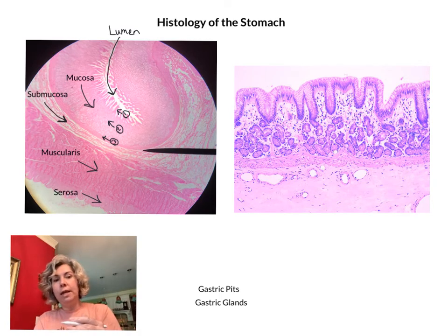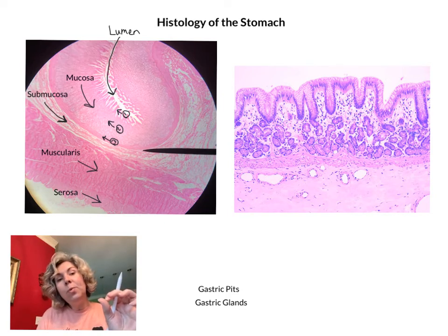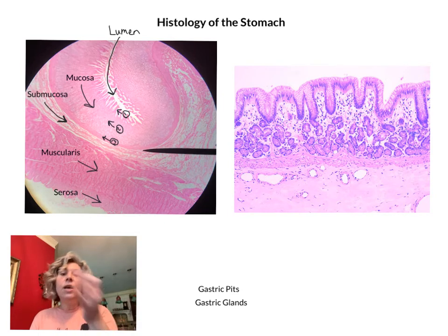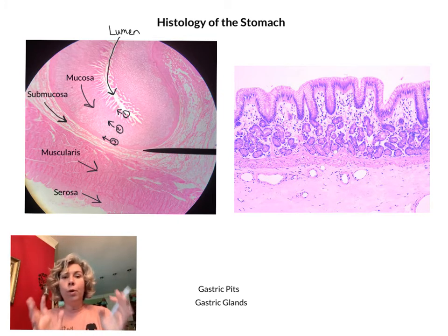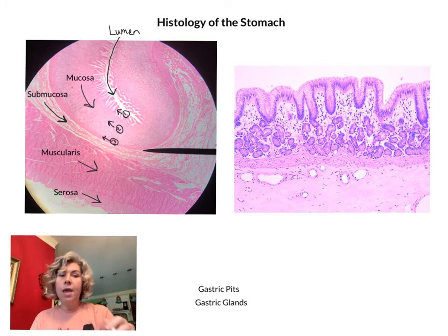The outermost area that comes in contact with the body cavity, the very bottom of that serosal layer, is epithelial tissue. It's actually simple squamous epithelial tissue. This is what we would call the mesothelium. And then a little bit deeper within, in contact with the muscularis, there are layers of connective tissue that help to support and attach your serosa with your muscularis. So here are our four layers of the alimentary canal: mucosa, submucosa, muscularis, and serosa. That's deep to superficial, okay?